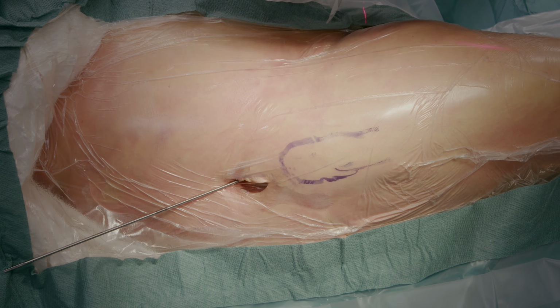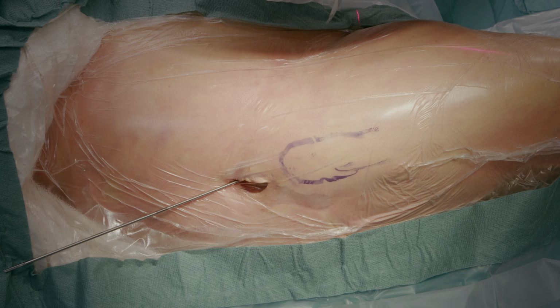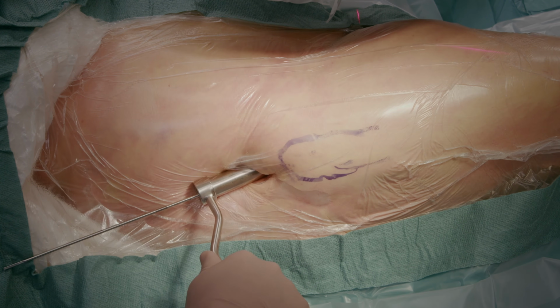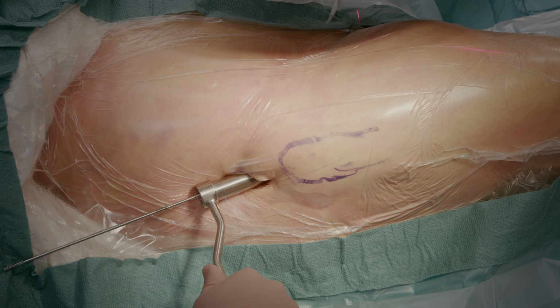Now we start opening the femoral cortex using this shorter reamer with the reamer sleeve for the proximal canal. For these short cephalomedullary nails, there's no need to ream the diaphysis, so the shorter reamer is enough.